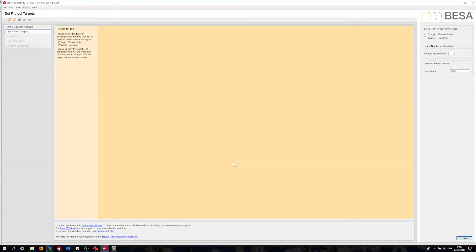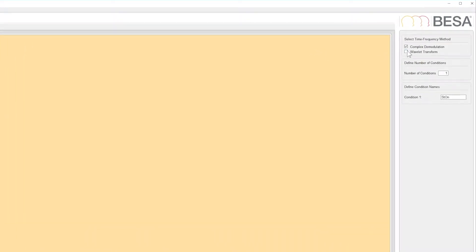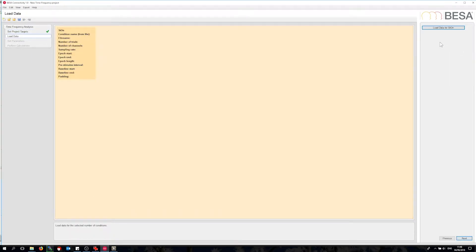I can see that I am already in the time frequency analysis workflow as shown here on the left. Now I need to decide which method or methods I want to use. I will go for complex demodulation as well as wavelet transformation using Morlet wavelets. The next step is to load the data.